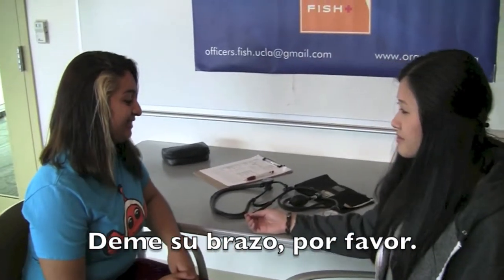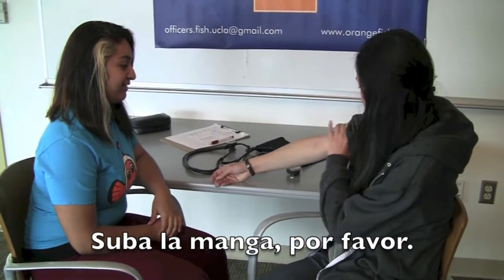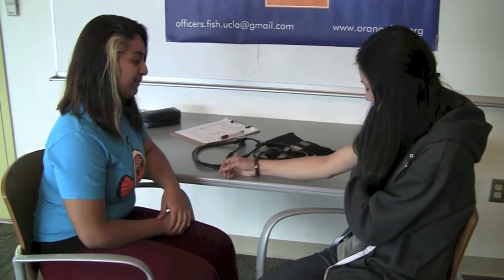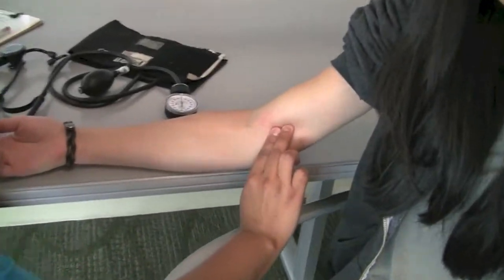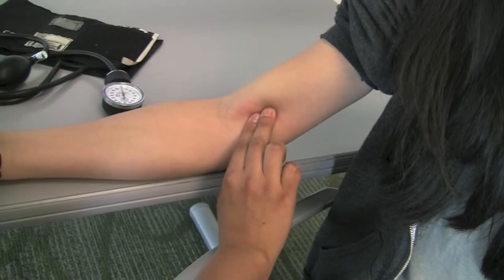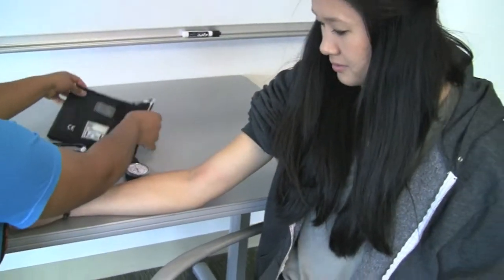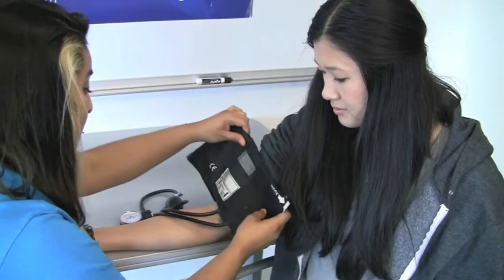If necessary, remove clothing from the upper arm of the patient. Locate the brachial artery by feeling for a pulse on the inside of the elbow, near where the bicep connects to the forearm. Place the blood pressure cuff on the patient's arm so the artery marker arrow points toward the brachial artery and wraps securely around the bicep.